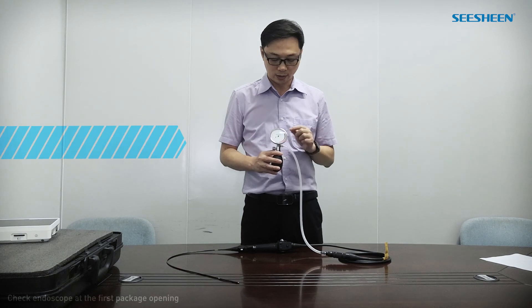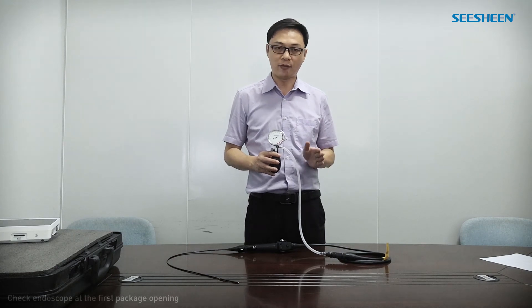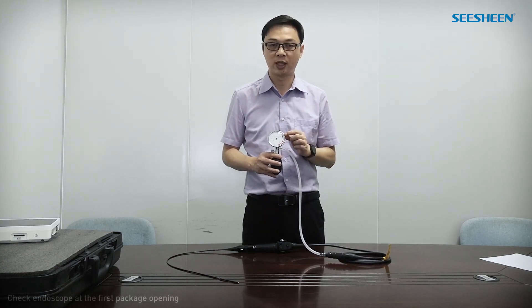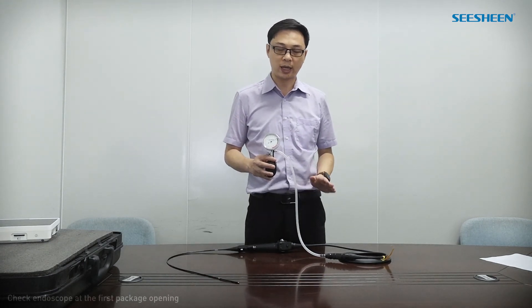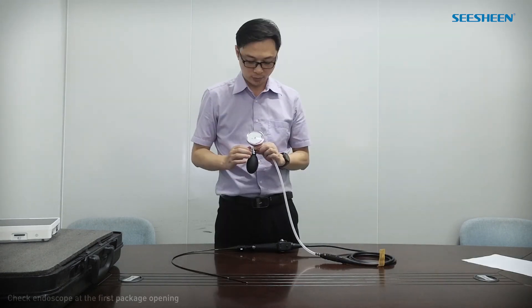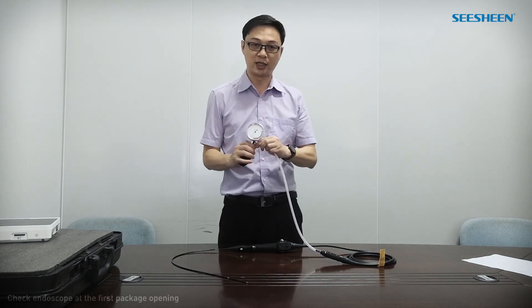After one minute, the pointer shall be still — that means there is no leakage. If after one minute the pointer still decreases, that means there may be some leakage in the endoscope, and you need to contact the supplier for after-service. If it is normal, then release the valve and disconnect the system.